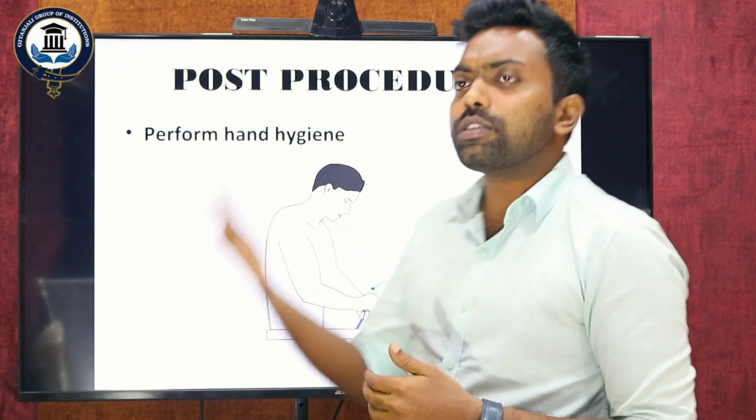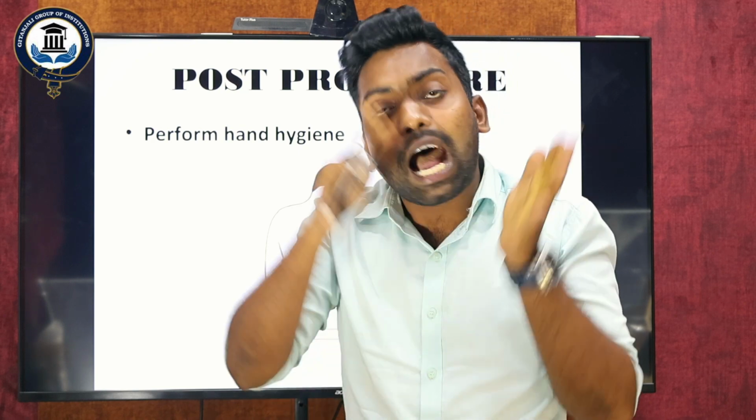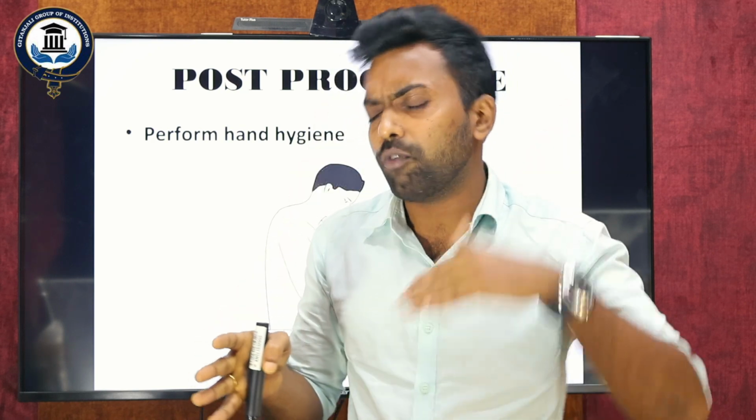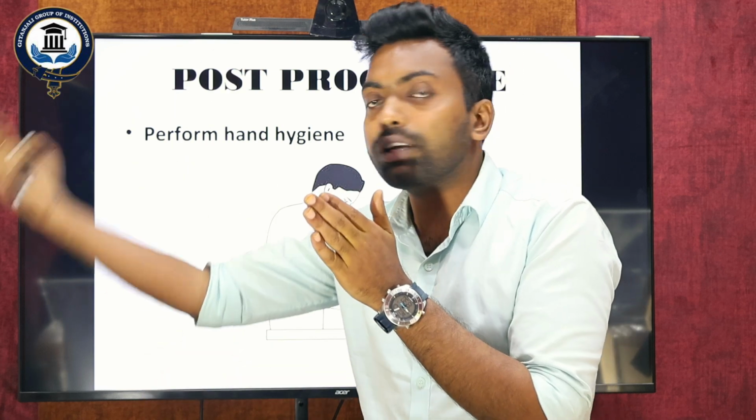After the procedure, go for hand washing, because you are touching the patient and doing a procedure for the patient. Before that, you must go for hand washing. After completion of the procedure also, whether it is the manual or the auscultation method, you must go for hand washing, because next you are going to touch one more patient.